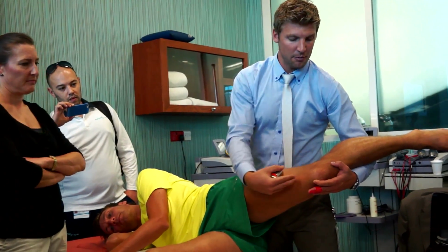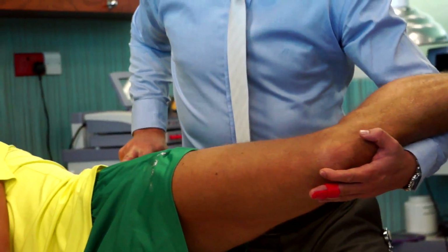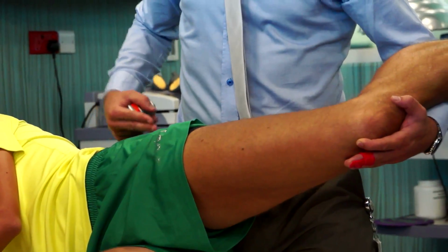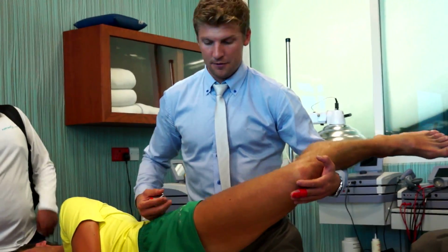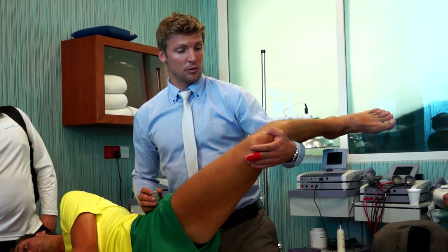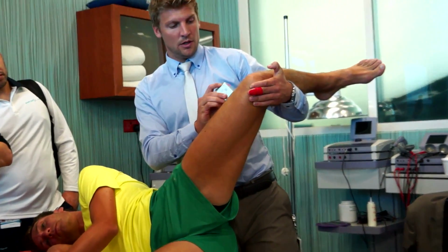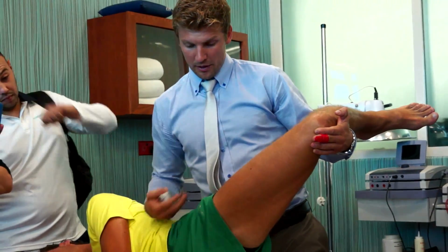And then from the markup, we have a markup point here, 5 centimeters proximal to the patella, that we did when he was lying on his back. And then we're ensuring that he's in 0 degrees hip extension, or in the hip in general. So the straight line here, and then you just move the leg up here. And if it's a big guy and a small girl testing, you just use your back to lift up here. So when you feel that now he's fully relaxed, and you go up to the end range here, you just put the inclinometer on the mark, and then you get the measure, and you do that twice as well. So here we have a more straight hip abduction movement, pelvis stable, and end range.